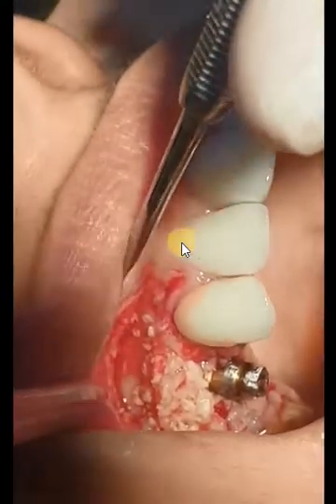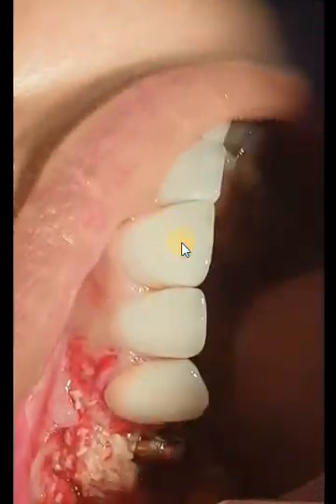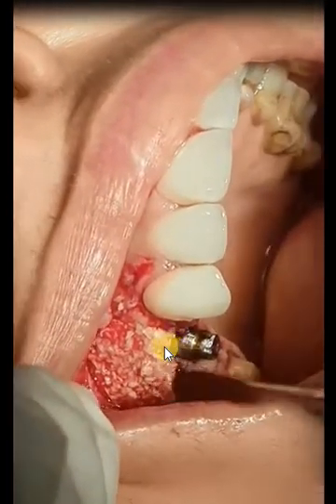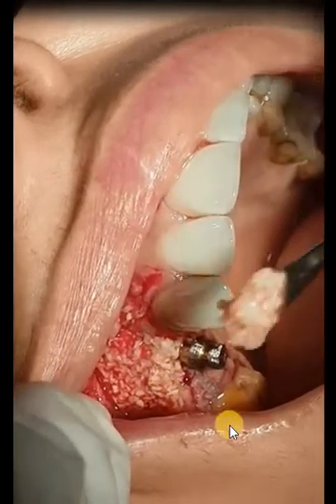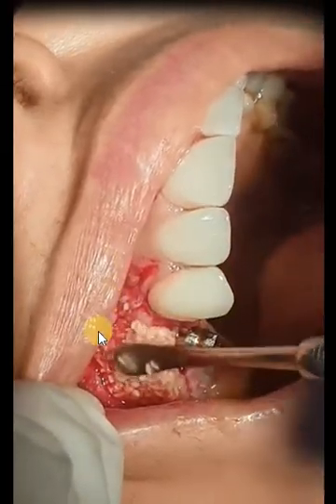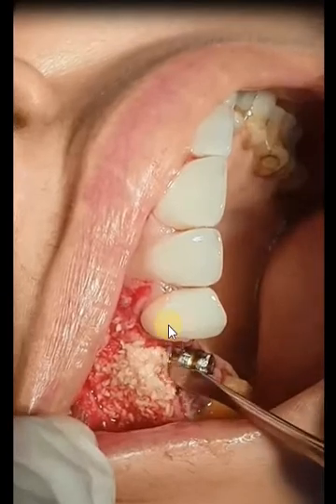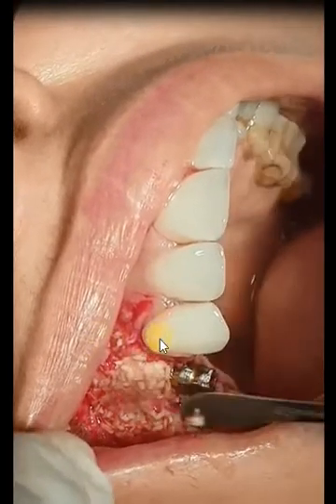So you should be aware while placing it to be more stabilized and more specific to the site of the defect. You can't put too little and also you can't put too much. Before that, we just released the flap and released the muscle tensions, so as to advance the flap coronally after that. Because we put materials, and this will put tension on the gingiva while suturing.